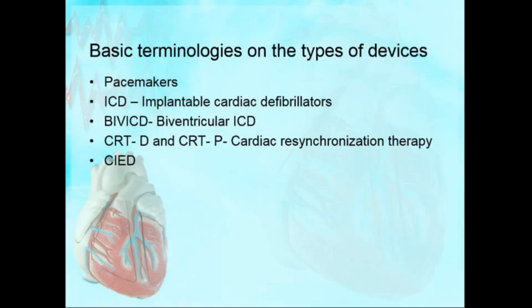So now there's an external cardiac defibrillator. Who gets it? Somebody who may need an implantable cardiac defibrillator, but you cannot put it in now for different reasons. Either it's an infection, or he hasn't met all the guidelines, his ejection fraction is low, but you're still working on all the medicines. So until then, you get an external cardiac defibrillator. The company that makes it is called LifeVest. I'm sure there will be more companies coming in future.